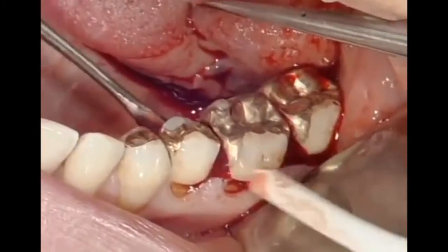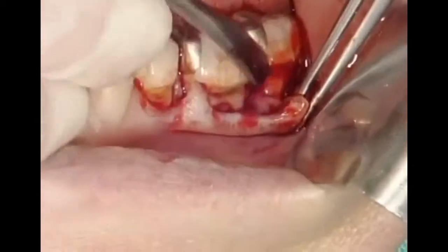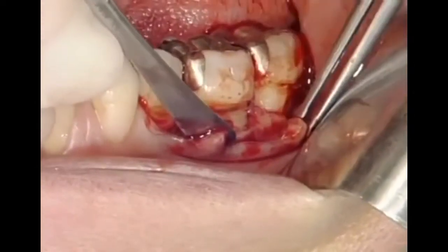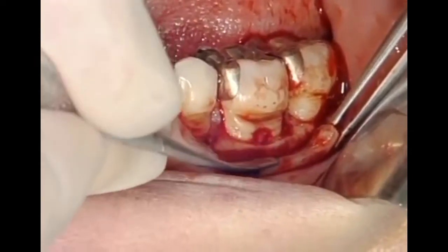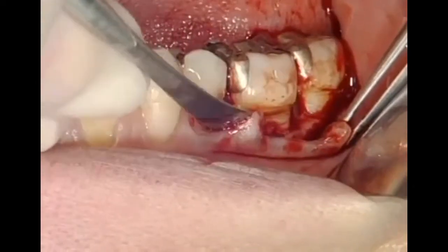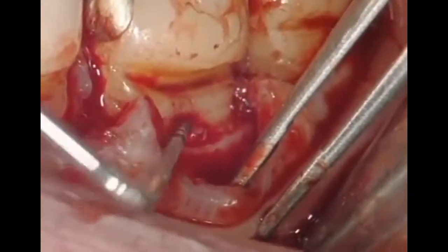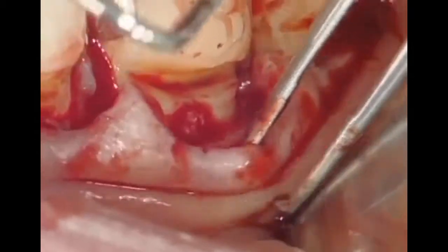A fine raspatory is used to detach the gingiva. Then a mid-size raspatory is used for the mucoperiosteal flap elevation on both the lingual and buccal sides. One should preserve as much of the gingival connective tissue in the flap as possible. The entire furcation defect is exposed, and granulation tissue becomes visible.